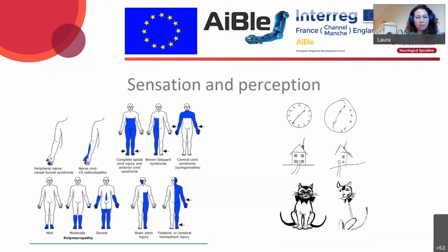The sensory loss will affect the person's ability to be able to find or localise specific muscle groups and successfully activate their hand and limb through a complex pattern of movement. Changes in sensation are also really important to consider when fitting any device to a person's limb, as the individual may not be able to inform you when or if the device becomes uncomfortable or painful, and they would be at risk of pressure areas or skin marking.